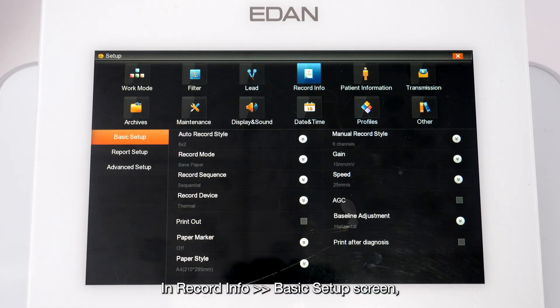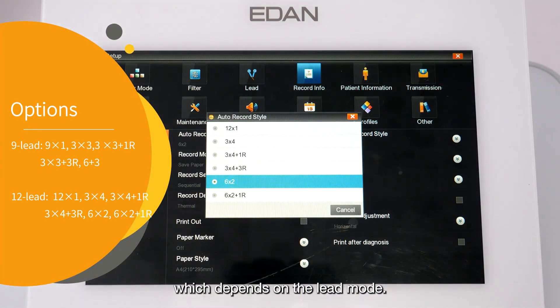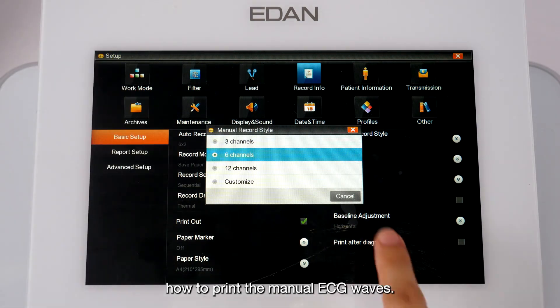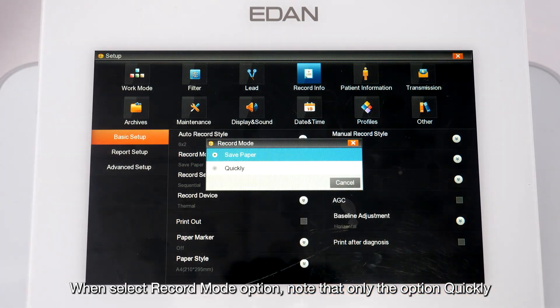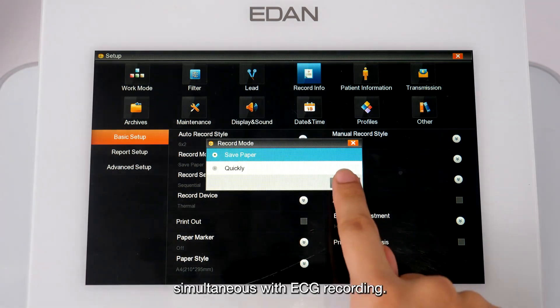In Record Info basic setup, click Auto-Record Style to determine how to print auto ECG waves depending on the lead mode. Click Manual Record Style to determine how to print manual ECG waves. In record mode options, note that only Quickly is available when auto-record style is set to 12 times 1. Save Paper prints the report after ECG recording; Quickly prints the report simultaneously with ECG recording.